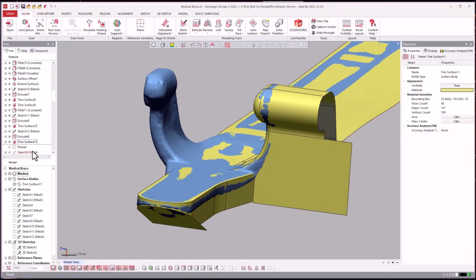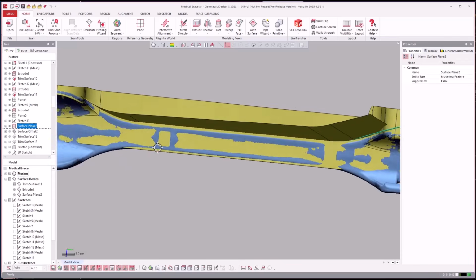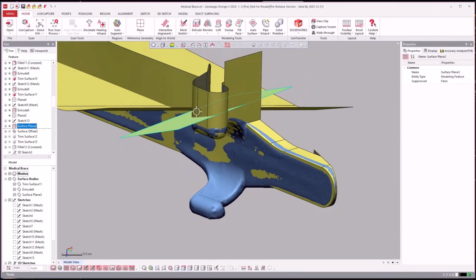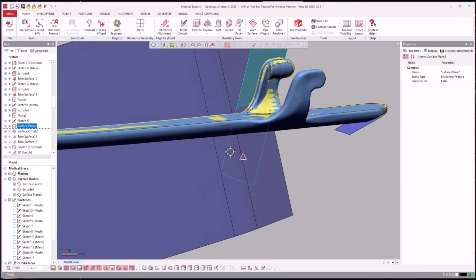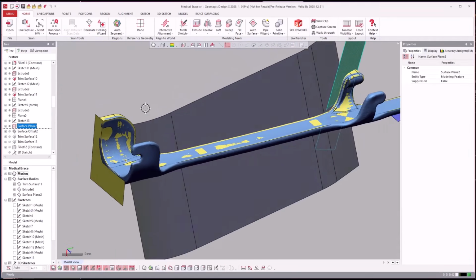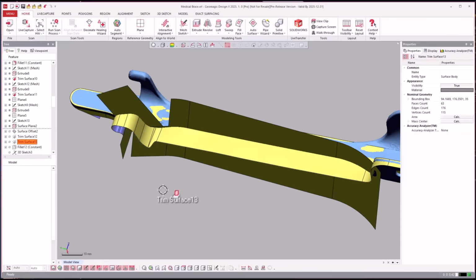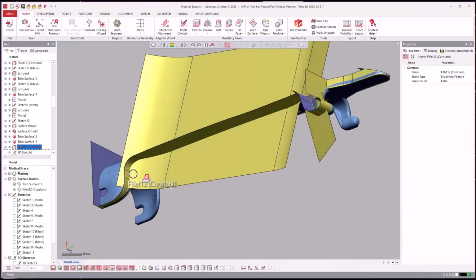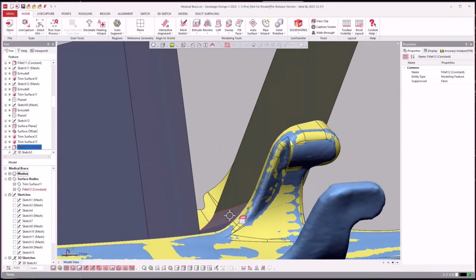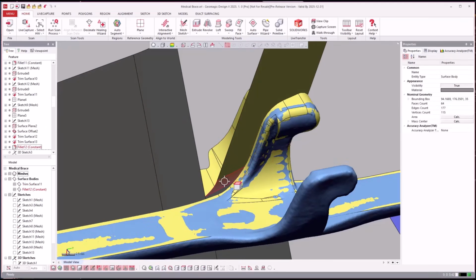So you see here, we're trimming all this. Couple more extrudes. So now we're going to come down the side. And we're going to trim the back here. So if I just turn the surfaces off for a second, you see here. So I think we're transitioning now from the inside to the outside. And now we're going to start trimming these pieces together here. So this one we applied the fillet to the tool first. This happens as well. Sometimes I might try to save the fillet and apply it later, but in this instance we're applying it to the tool that we're going to trim.